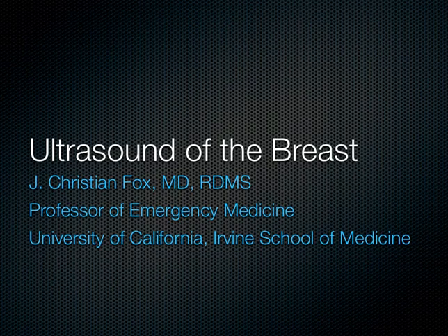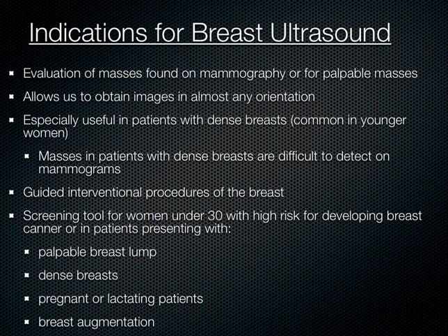Okay, today's lecture is on ultrasound of the breast. Now, you're probably wondering, why would you scan a person's breast? Well, here are the various reasons one would do that. These are the indications, if you will.